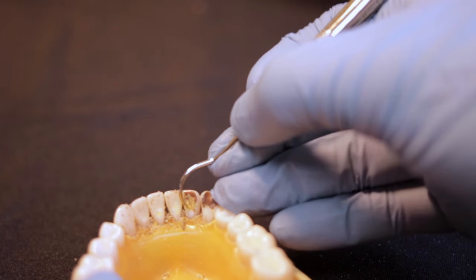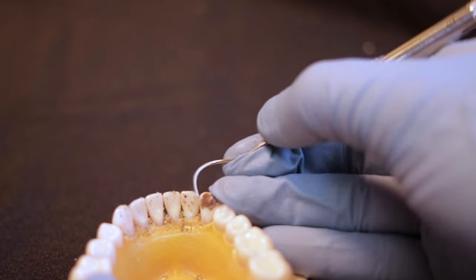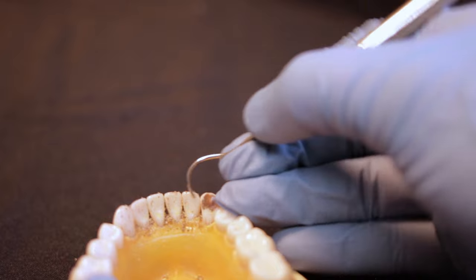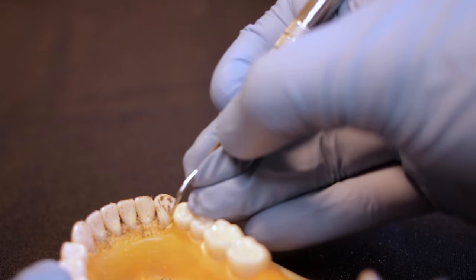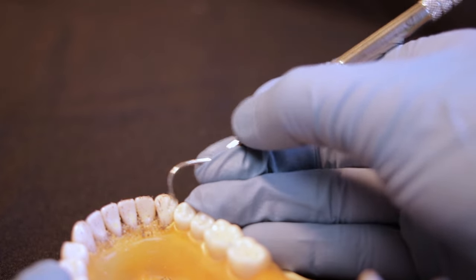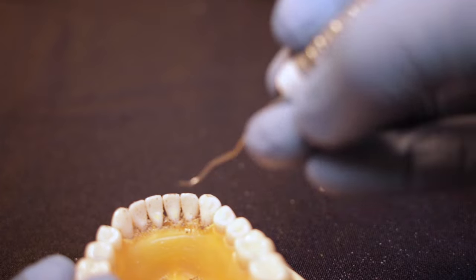When someone has this much stain and it's a very thick type, it can come from coffee combined with smoking — smokers tend to have very thick stain on these lower anterior teeth and maxillary linguals. I recommend you practice scaling the lower anteriors probably ten times through, because this is where students tend to miss a lot of calculus. The more you practice at home in the proper position with your patient in the proper position, the better you'll be when you actually encounter that much calculus.